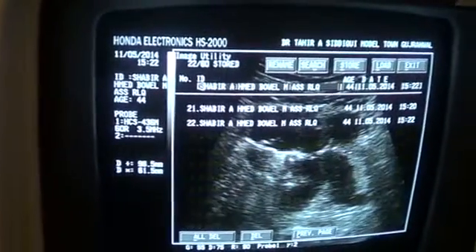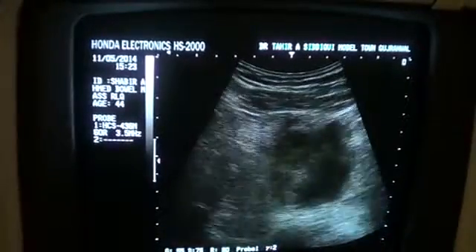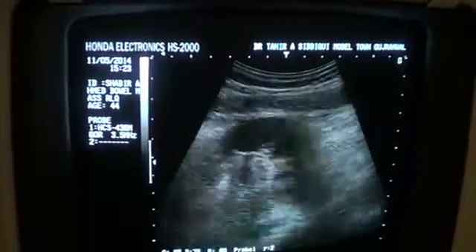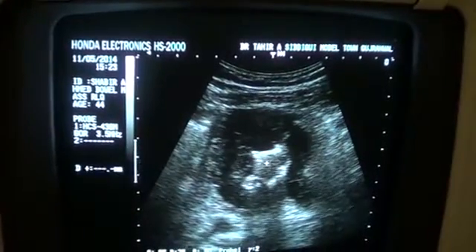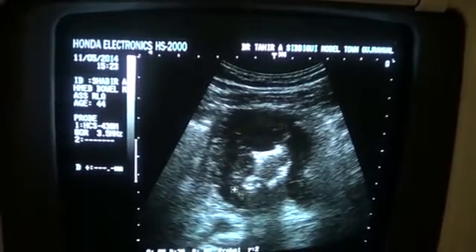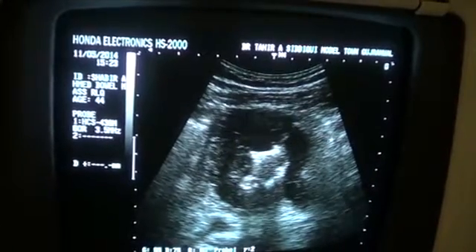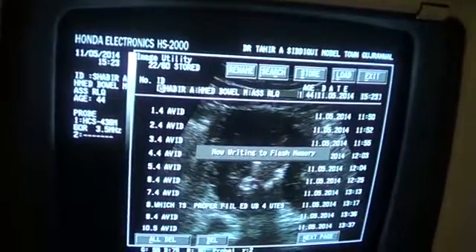Ileocecal mass, most probably of infective nature. It is not of an aggressive nature. So this is the lumen, and you can see the fluid compartment of this echogenic area of this bowel mass.